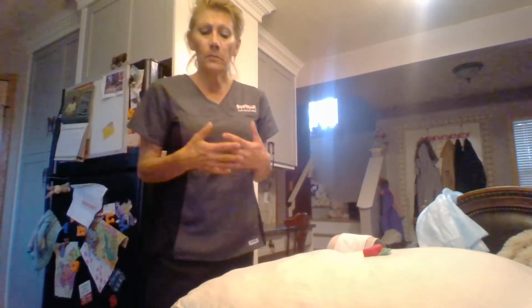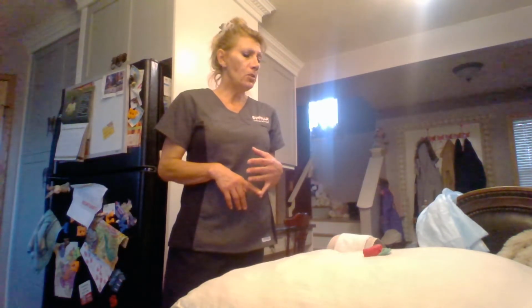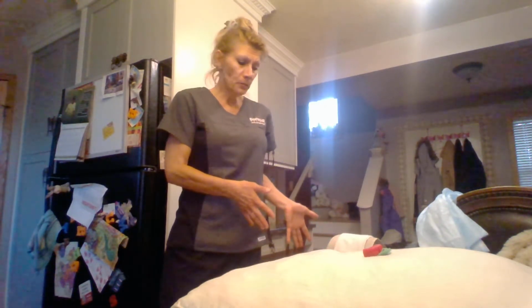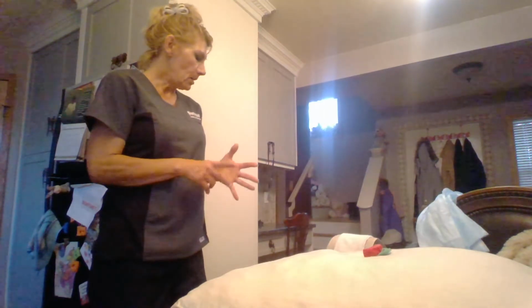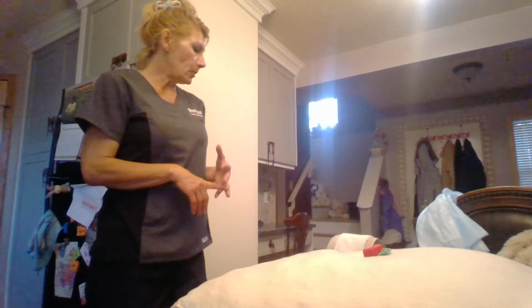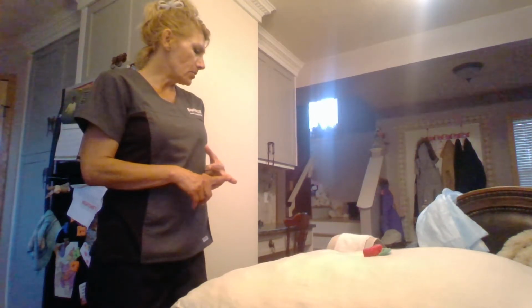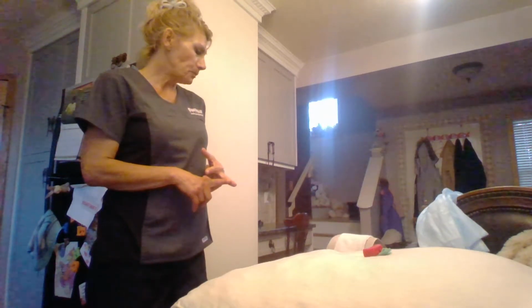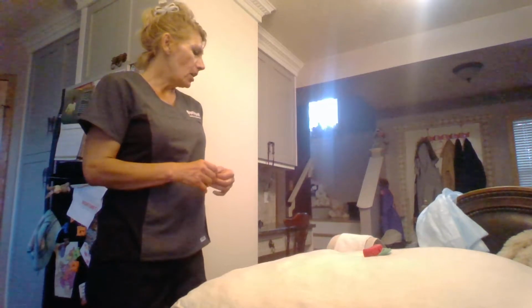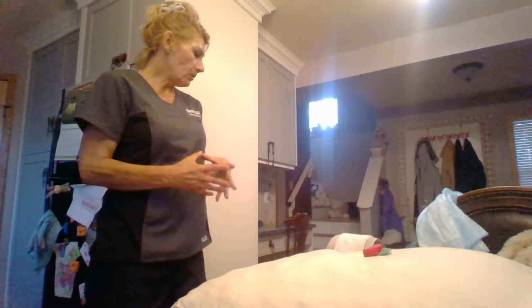You've gone through your safety of the bed. You've checked your brakes. You've brought your supplies. You've brought the pouch system on the person's care plan. You've brought your adhesive remover. You've brought deodorizer for the bag. You have hand sanitizer. You have a pair of scissors. You have a pen. You have a measuring chart for the stoma.